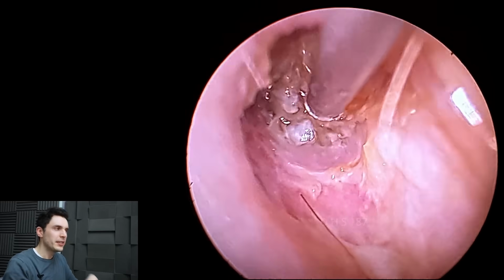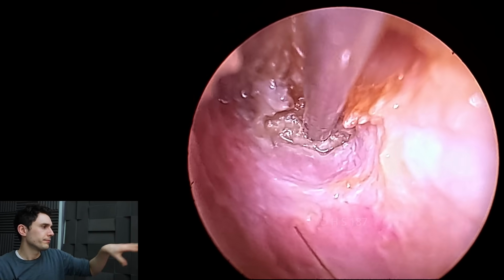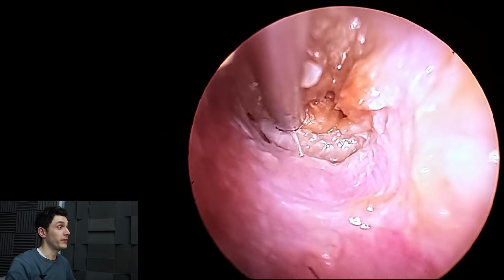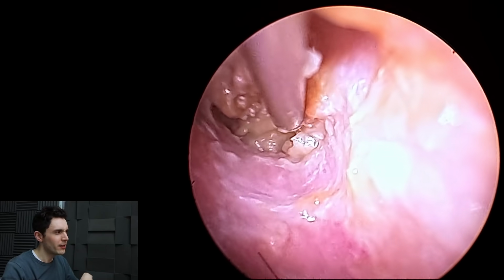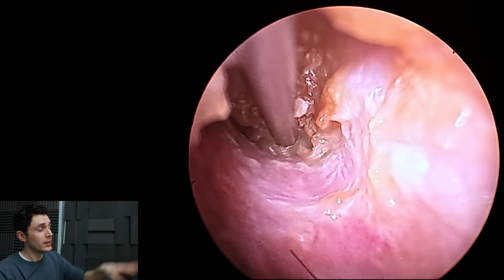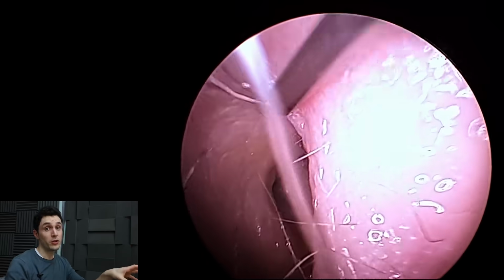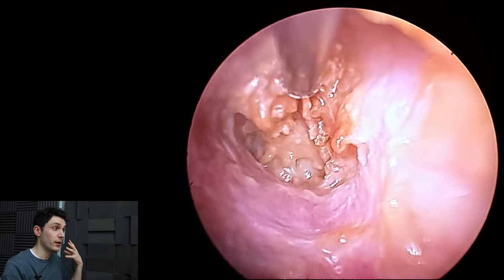So in any case, didn't get a good sample, but I'm not overly worried, to be honest. It's purely academic. So the real problem, as you can see, is that aside from the fungal infection, which tends to cause a lot of itching, and that's exactly what this patient reported, insatiable itching in the ear, which has developed into a pain, and significant hearing loss. We see that there's wax compacted right down to the drum. Now, even though we've improved the situation a little bit, and we are down to the drum at this point, the hearing loss is still quite apparent.